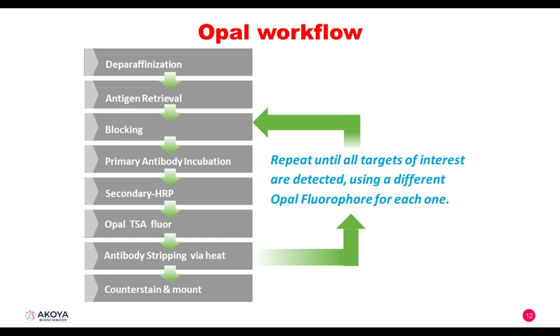Now, what does the OPAL workflow look like? The workflow is sequential, and it looks very similar to the staining that most labs are currently doing.